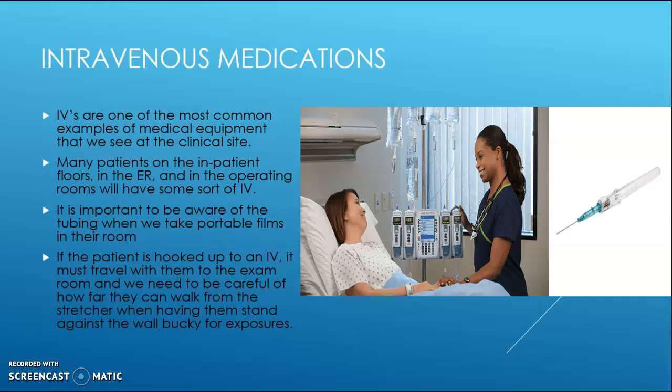If the patient is hooked up to an IV, it must travel with them to the exam room. We need to be careful of how far they can walk from the stretcher and having them stand against the wall bucky for exposures. Again, don't want to rip any IVs out.